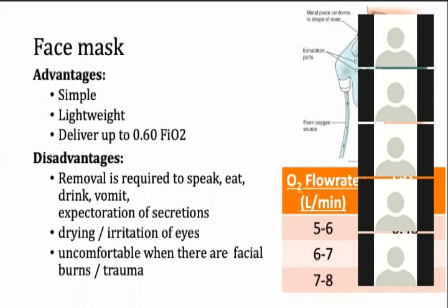So advantages are it is somewhat cheap and it is available in every ward setup, in ICUs and theaters, everywhere. It says it can deliver about 60%, but practically it is not so. We might not be able to go above 50% of oxygen.